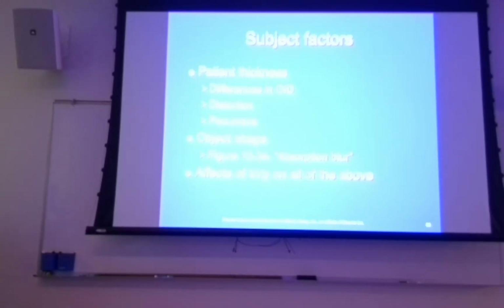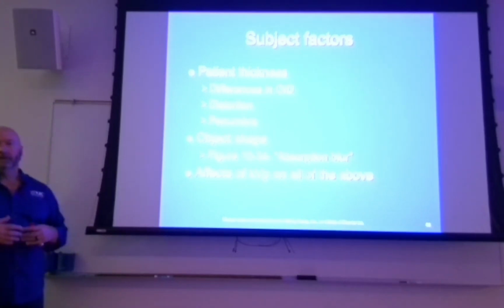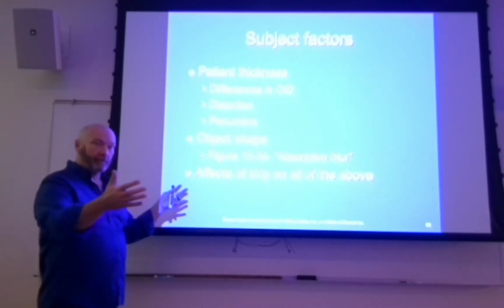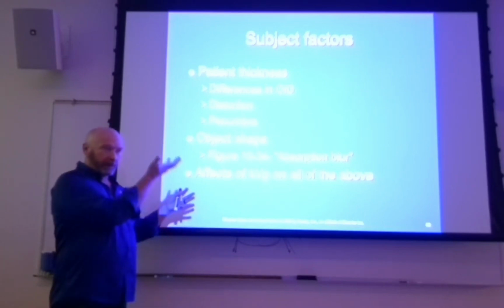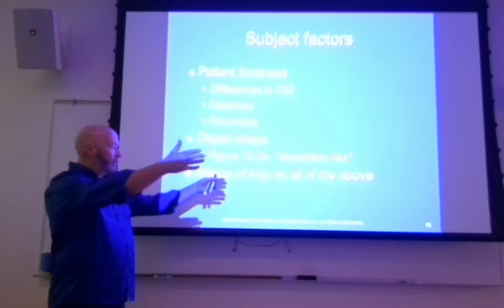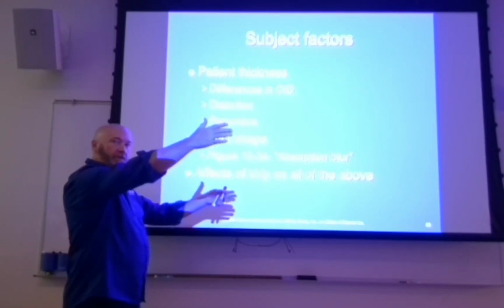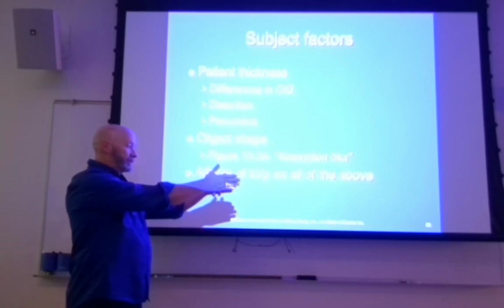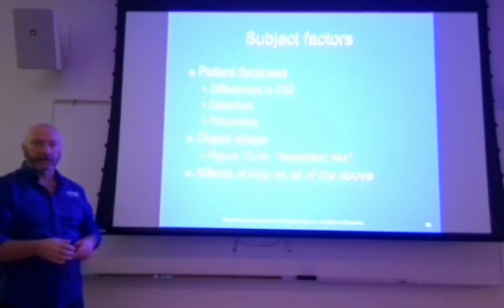You see that if you remember back to when we were talking about lordotic chest x-rays, right? And clavicles. If you had a patient who was really thick, barrel-chested, you needed less of an angulation because those clavicles are going to move a whole lot more on a patient who's really thick. Just a little bit of difference, but if you have a patient who's really thin, you got to move quite a bit, a lot of angulation, right?